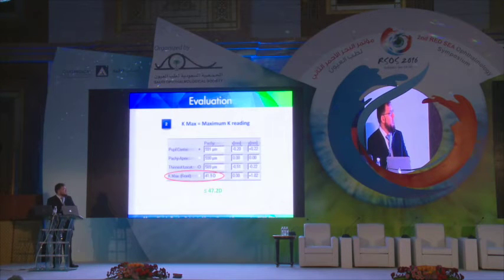The cutoff point for the Kmax is 47.2 diopters, above which it is abnormal. When I say abnormal, it does not mean keratoconus. It is just abnormal. Keratoconus is a syndrome. It is a collection of abnormalities. The cutoff point for the thinnest location is 500 micron. The cutoff point for the Y coordinate or the vertical displacement of the thinnest location is minus 0.5. Minus means downward.